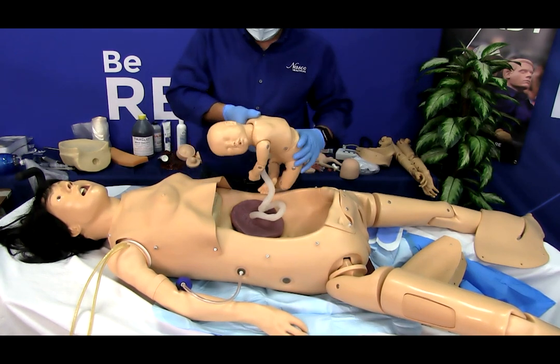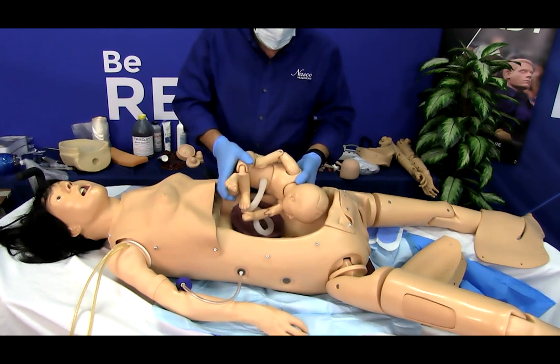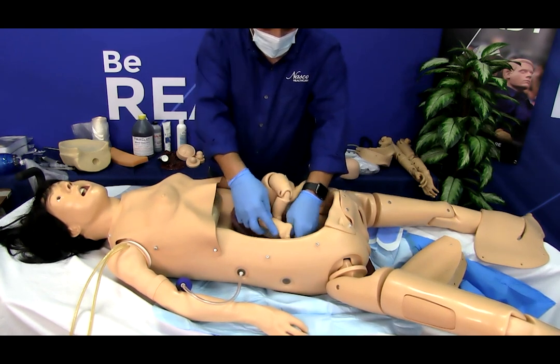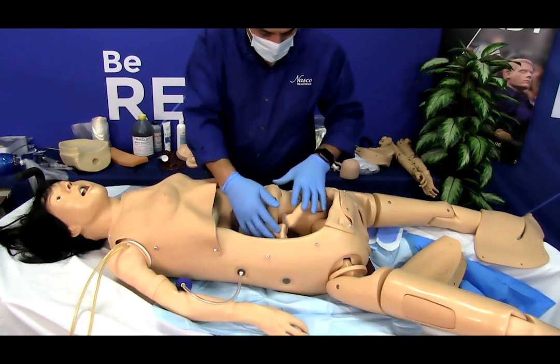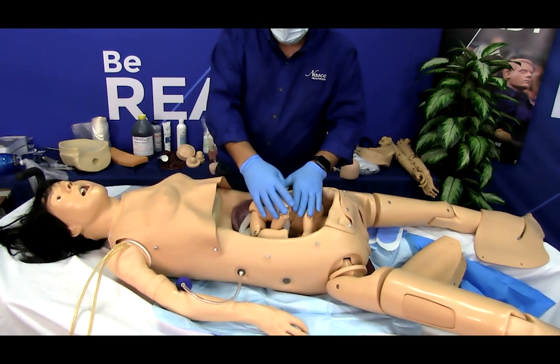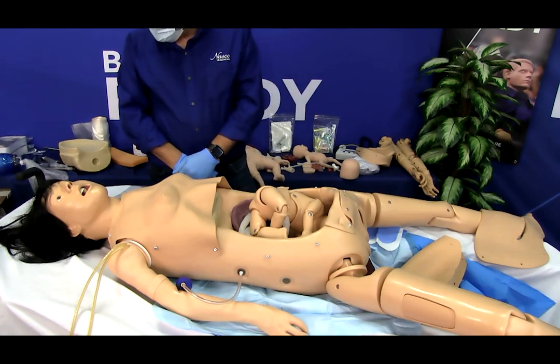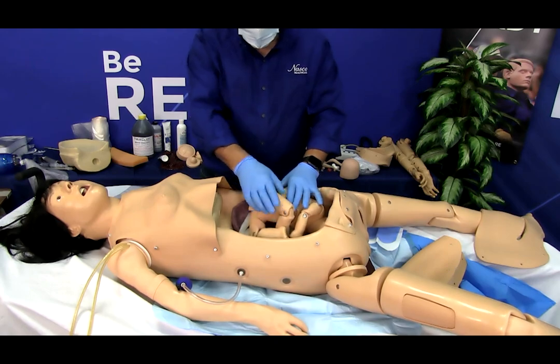Connect the remaining end of the umbilical cord to the fetus. Position the articulating fetus in the abdomen. The abdominal skin may be installed or left off so the instructor has better access to manipulate the fetus. The fetus may be placed in an included clear plastic bag to simulate the amniotic sac.